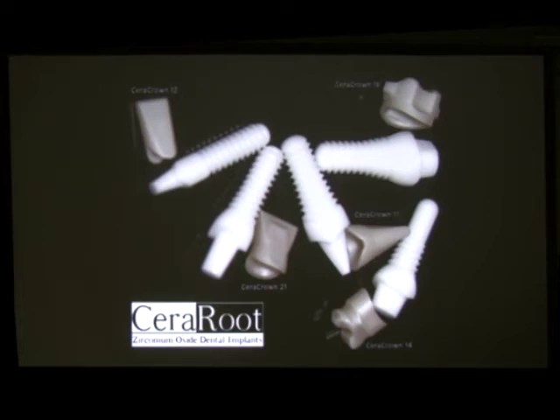But if it's not retentive, sometimes what we do is we make 2 holes on the Essix, and we make a veneer on the inside and we make a veneer on the outside, connected with the 2 holes in the plastic. So the patient wears the Essix normally with the inside veneer of composite. And this veneer is very easy. With a flowable composite, even our assistants do it.